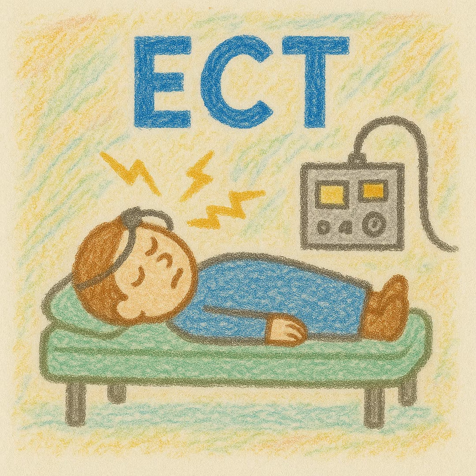The next parameter that we can control is the frequency. So how dense, the frequency of these individual pulses. This is measured in hertz. So if you take a second and you just count how many pulses there are in a second, that's basically your hertz. So 20 hertz, 20 pulses in a second. So the hertz can range from anywhere from about 20 to 100 and something hertz.